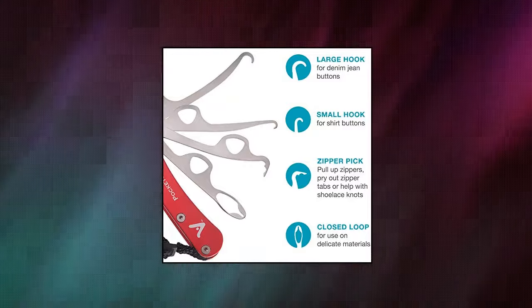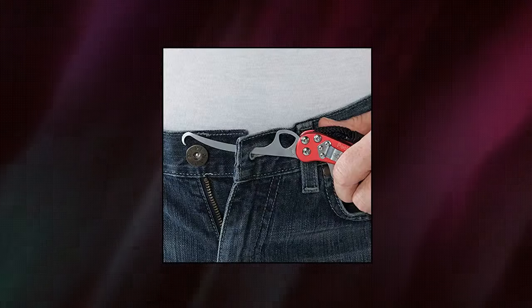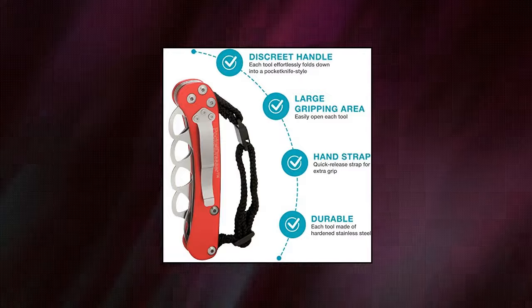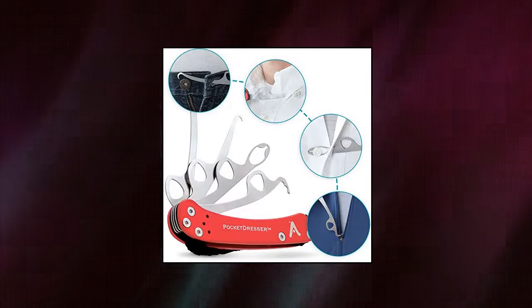Large hook for pants button assistance. Small hook for mid-size shirt button assistance. Zipper shoelace pick for pulling or prying out zippers and untying shoes or releasing knots. Closed loop for delicate materials with smaller buttons.